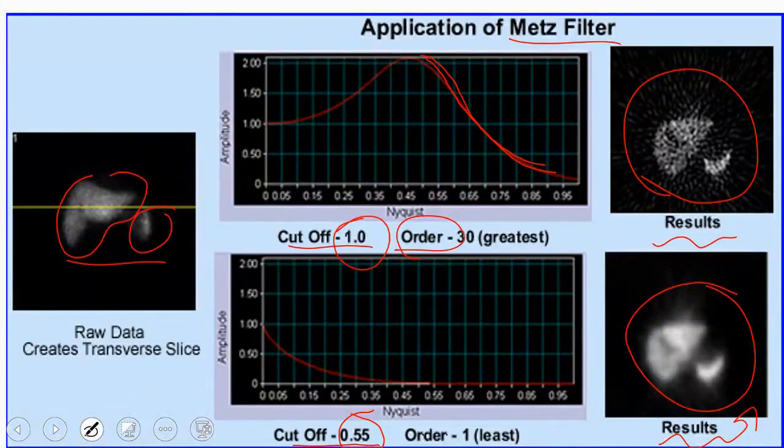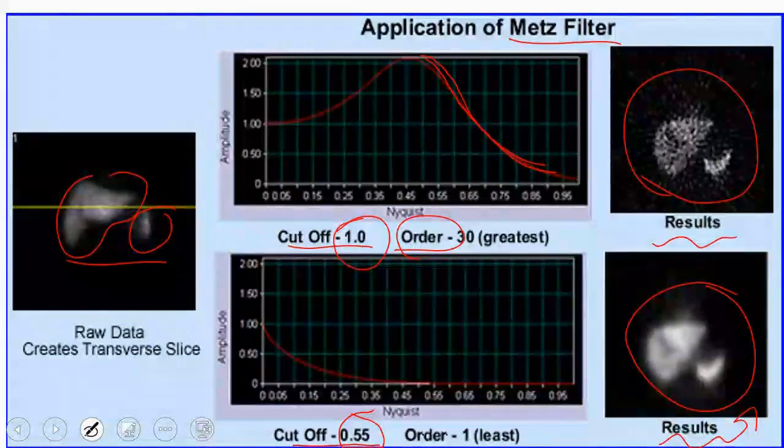Filters play a very important role, as we mentioned, in removing the noise present in the image and smoothing it out in nuclear imaging. The role of the filter is somewhat more apparent in CT and X-ray imaging.